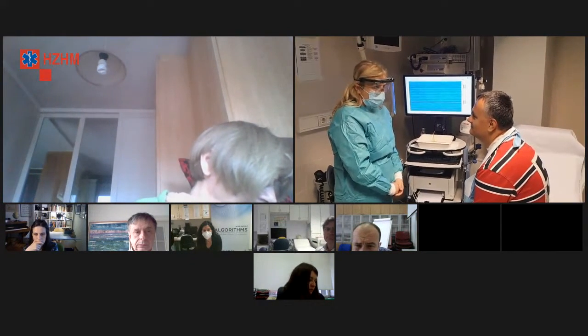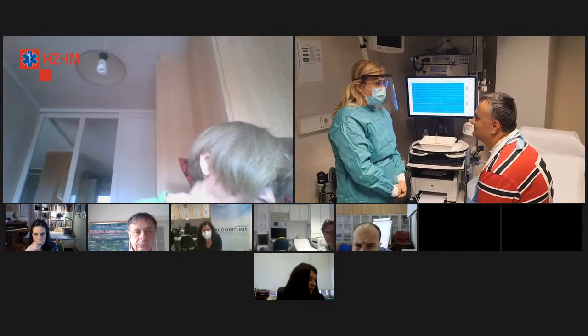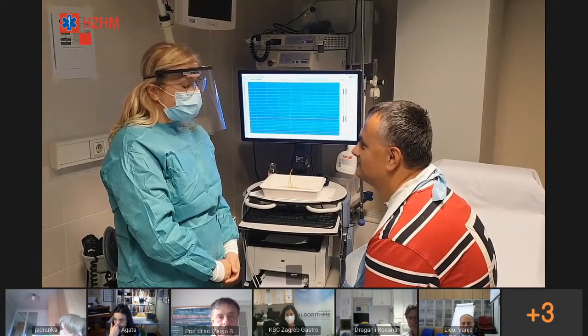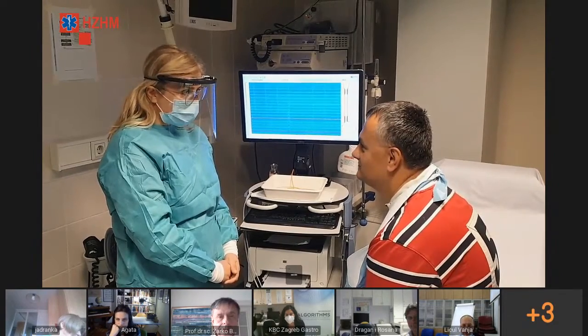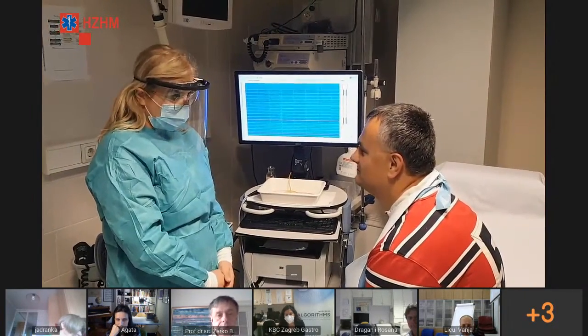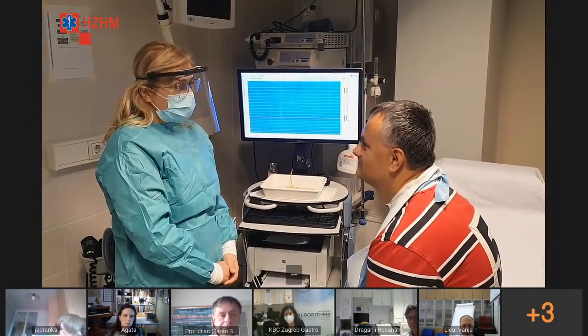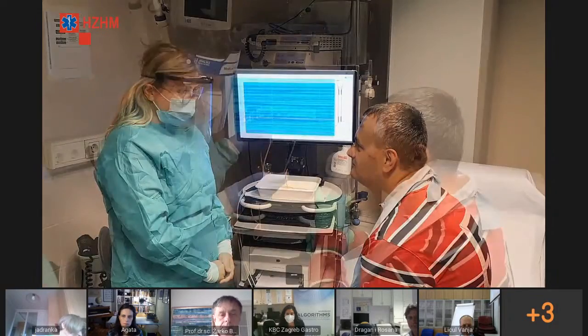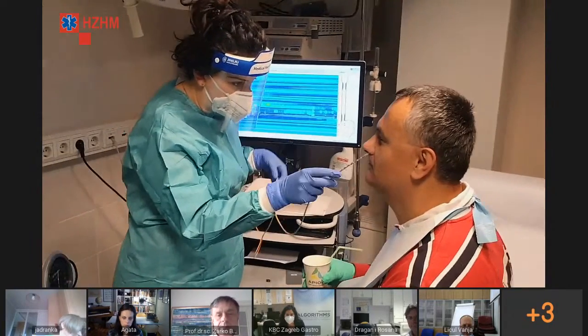To je više-manje sve od nelagode. Ostatak testa sastoji se od toga da ćete malo mirovati kroz 3 minute i onda ćemo krenuti na test s vodom. Daje se 10 gutljaja po 5 ml. Kad vam damo 5 ml vode, kažemo da progutate, i 30 sekundi nakon toga nema gutanja. Dobro, sada ću lagano krenuti.